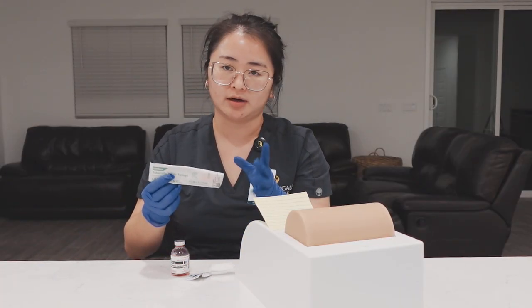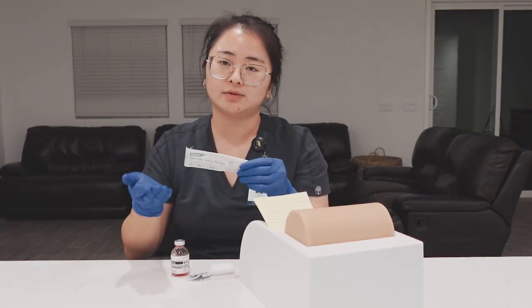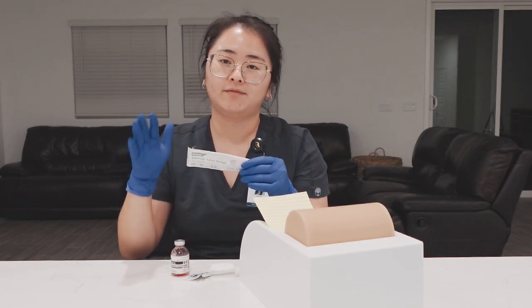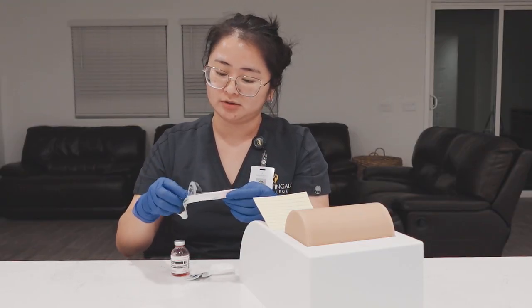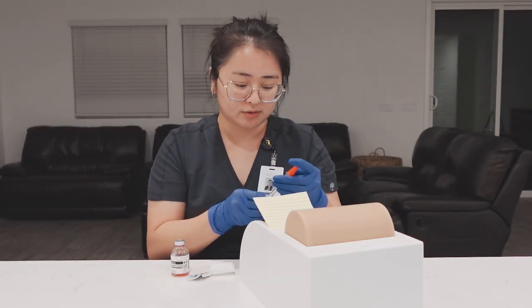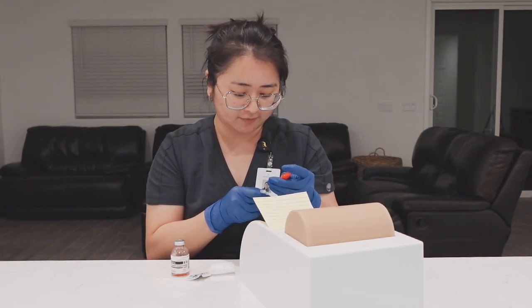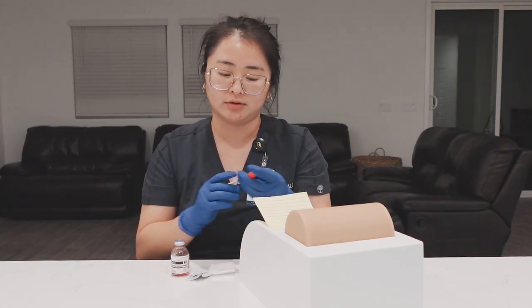Naturally, we're not going to blow on it, we're not going to fan or anything. So we're going to use this needle today. For the syringe, it is 1 milliliter, and for the needle, it is a 5/8 inch and a 25 gauge. So I'm going to throw that away, and before we actually uncap the needle, we're going to draw 1 milliliter of air because that is the amount of the dose that we're going to give the patient.